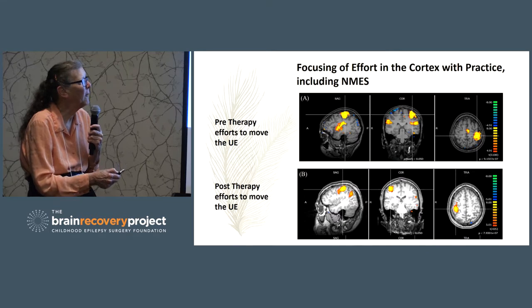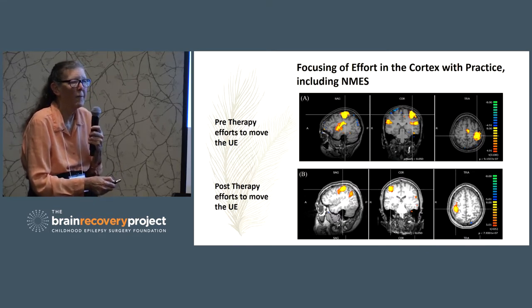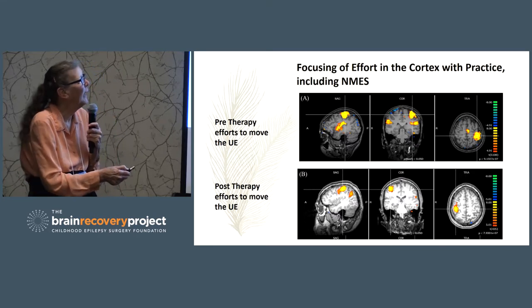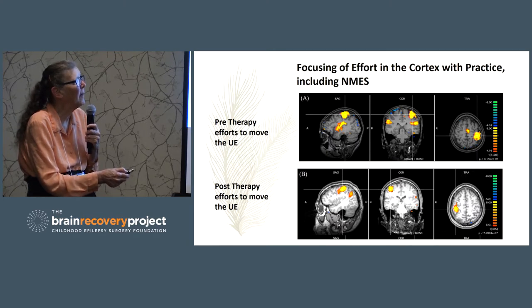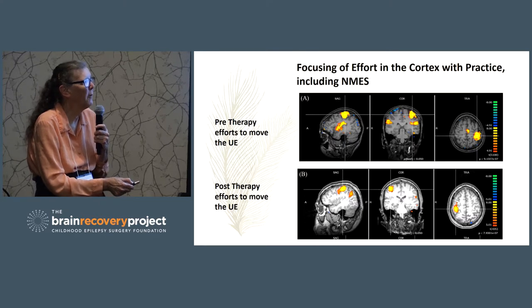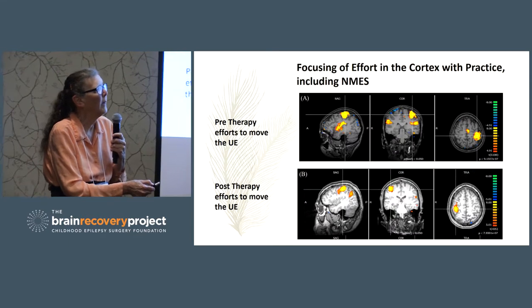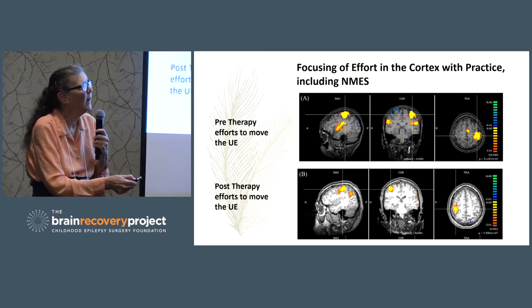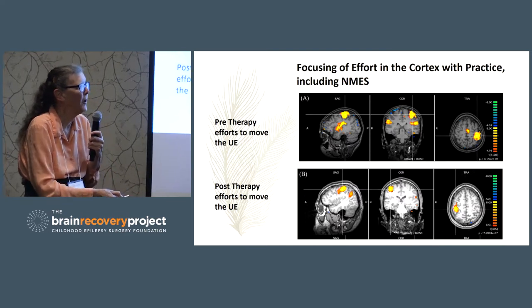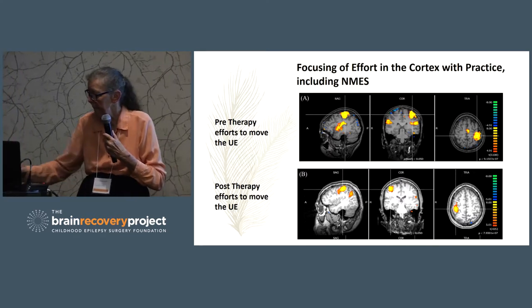This was all active, and now a much smaller area is active. That's typical of skilled movements. And here we had a lot of activity on the uninvolved side. Now it's almost all on the involved side and is contributing to the more natural movement. Same thing over here. We switched the activity from the uninvolved side to the side where there had been damage. And you can see that it's relatively well focused. Okay?